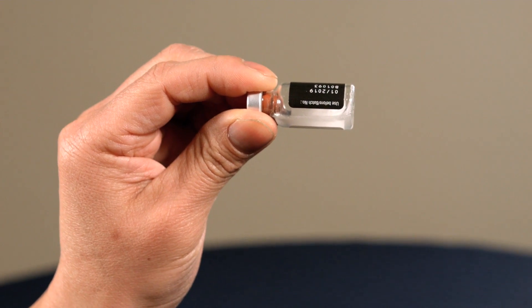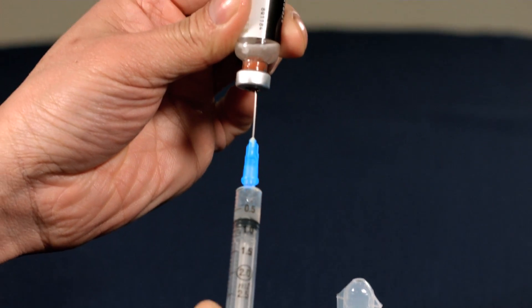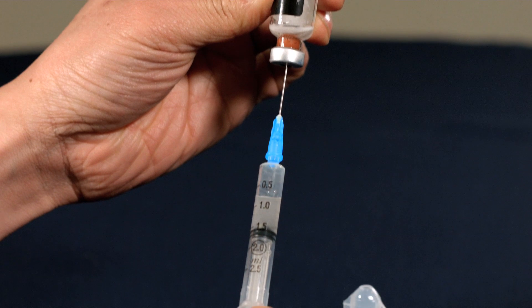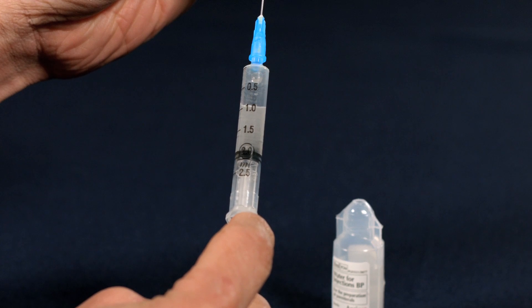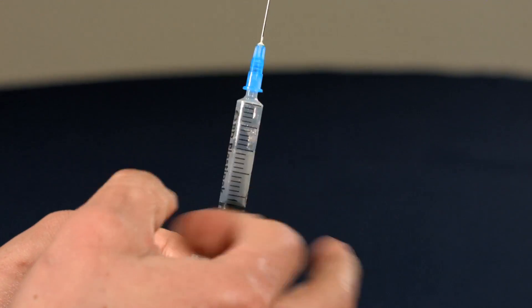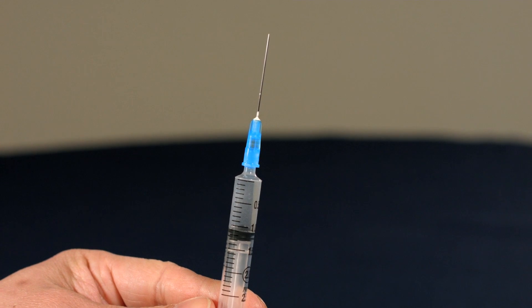Once the liquid has become clear, insert the needle back into the rubber stopper. Tip the Solucortef bottle upside down, drawing up all of the solution into the syringe. Hold up the syringe to eye level and tap the side to loosen any air bubbles. Remove any air by squeezing the plunger until a drop of liquid appears at the tip of the needle.